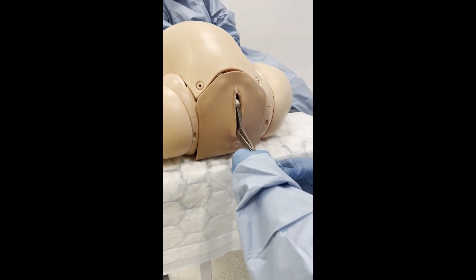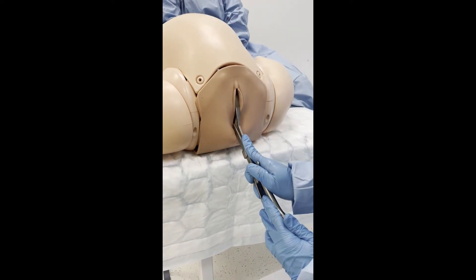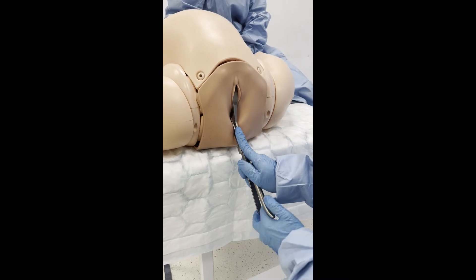After both blades have been applied, check that their position relative to the suture lines is correct. Check that the blades lock easily.